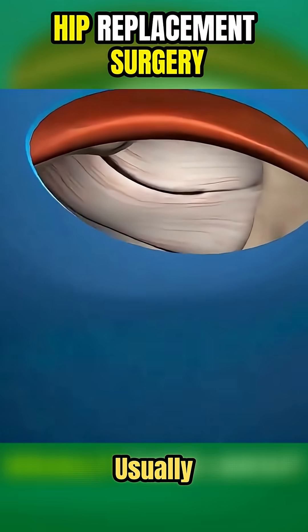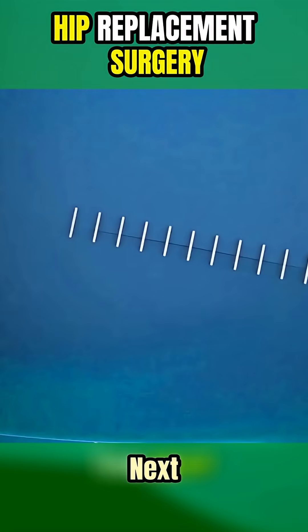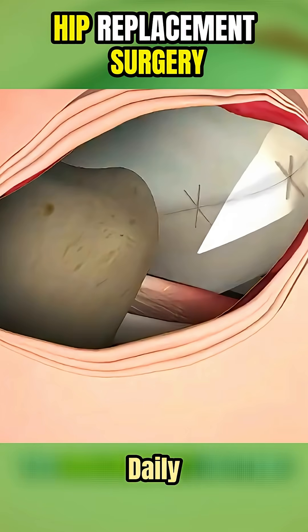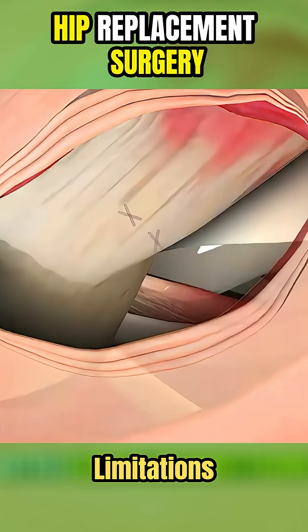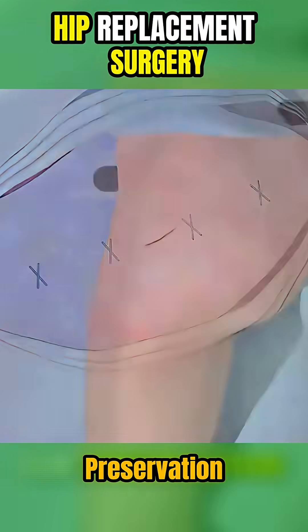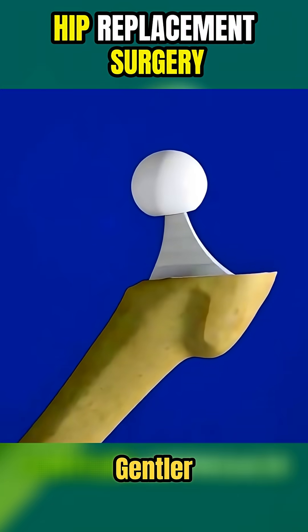The entire procedure usually takes about an hour, and many patients go home the same day or the next. It's especially helpful for people who want a quicker return to daily activities with fewer limitations. SuperPath combines precision and preservation, offering all the benefits of hip replacement with a much gentler approach.